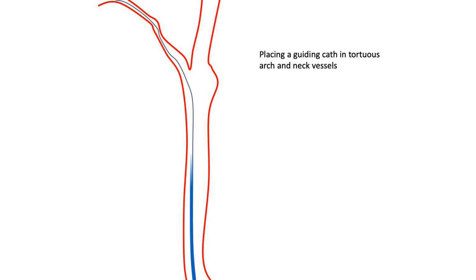Once you've done that, you will take a catheter across, pull out the wire, replace it with an extra stiff wire, pull out the catheter, take a long sheath now over the extra stiff wire, and now you are ready to do the procedure. Technically, you can just about introduce a little bit of the soft end of the extra stiff if you want, carefully, and then you can push your sheath a little higher and you are in a stable position.